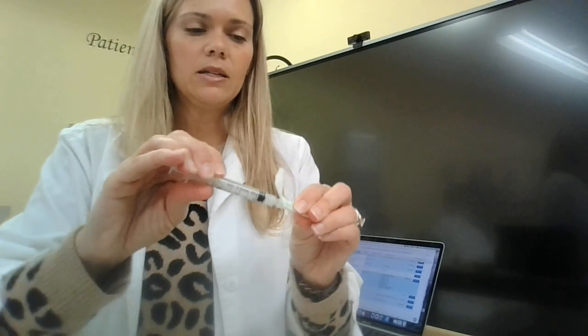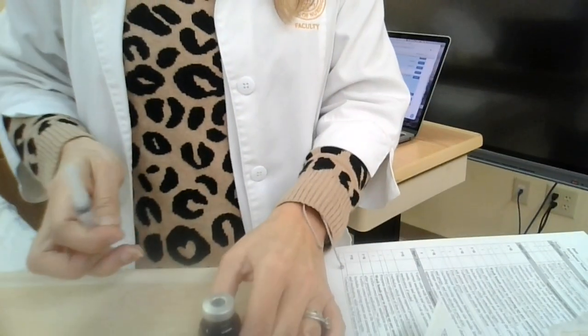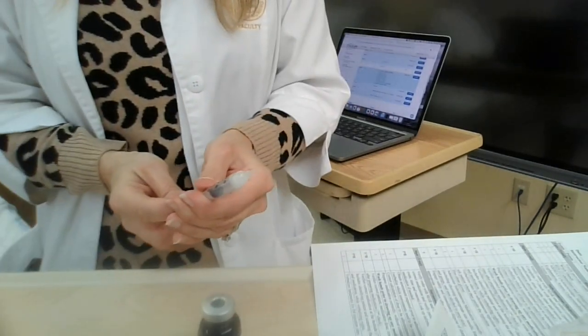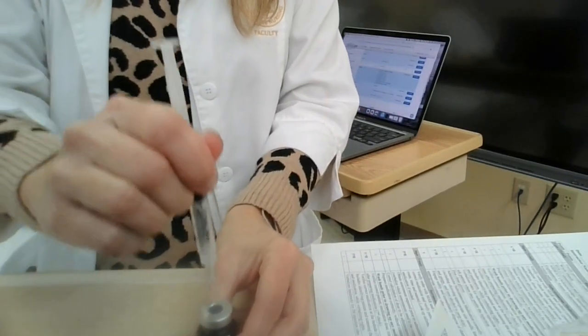So I'm going to connect these two pieces. Before I go into the Lasix, we're going to clean the top vigorously, 3 to 5 seconds. And now I'm going to go ahead and put in air what I'm taking out in volume. We said 20 milligrams is 2 milliliters.